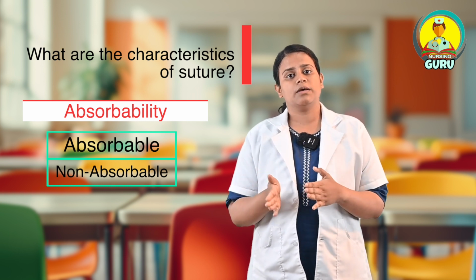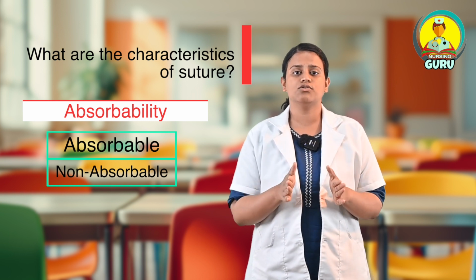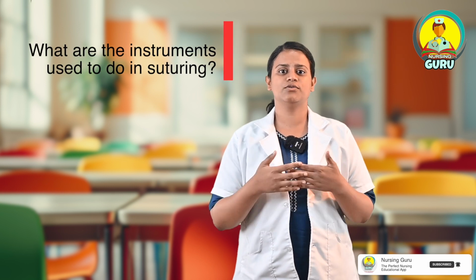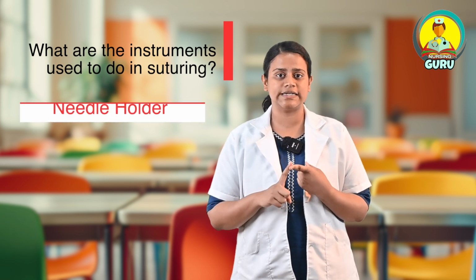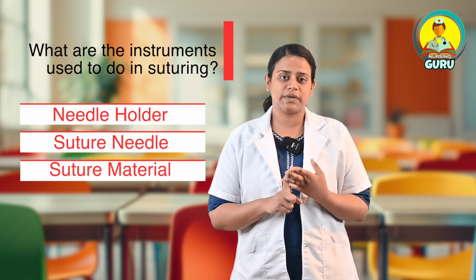Whereas non-absorbable sutures are used only in those wounds where we can remove them very easily and it doesn't cause any harm. Next we will discuss the instruments that are required to do suturing. There are three important instruments required to do suturing. The first one is the needle holder, the second one is the suture needle, and the third one is the suture material.